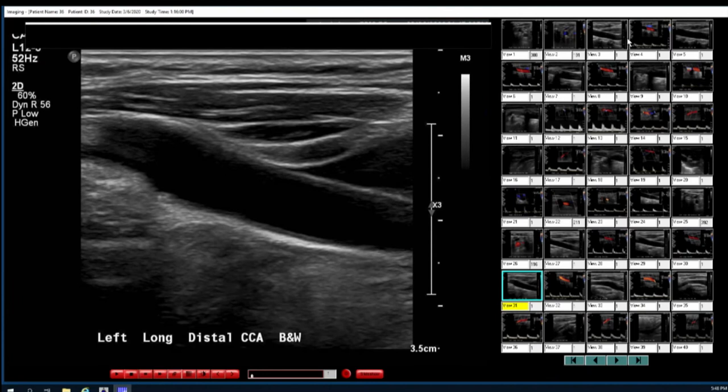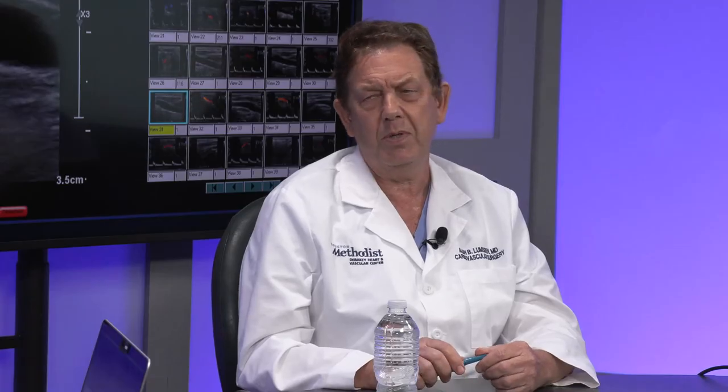But what you would like to do before you go to the OR, can you show my Mac, please? So you would like to have one more test done. I would absolutely like to. There are two parts to this. Number one, we do transcranial Doppler on all the people we're going to take to the operating room, for two reasons. Number one, it tells me there are windows, and number two, it gives me additional information about how the brain has compensated. So let's pull up the slide that shows the preoperative TCD.